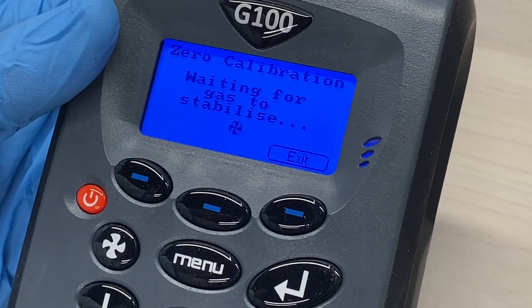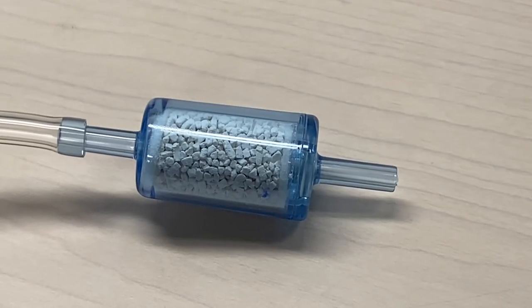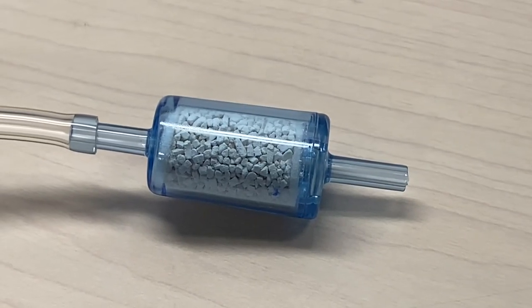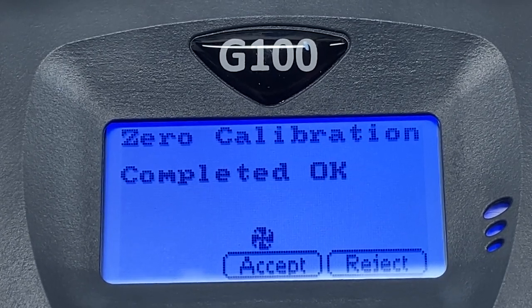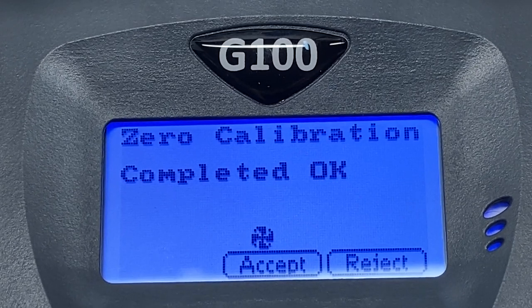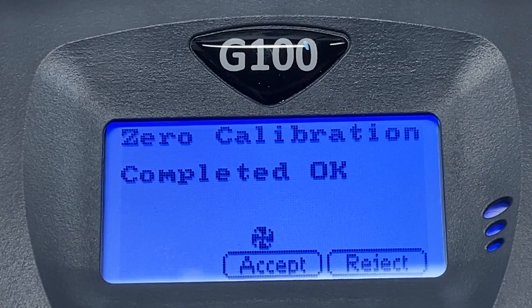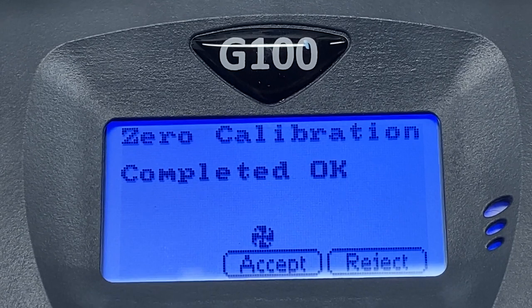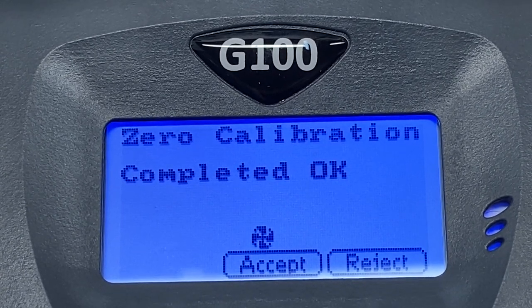The instrument will take about 60 seconds to stabilize the gas reading at the correct level. When completed, the instrument will indicate a successful zero. Press the soft key Accept to confirm the calibration and store the new user offset. If you do not want to save the change, press the soft key Reject to exit without storing the calibration data.